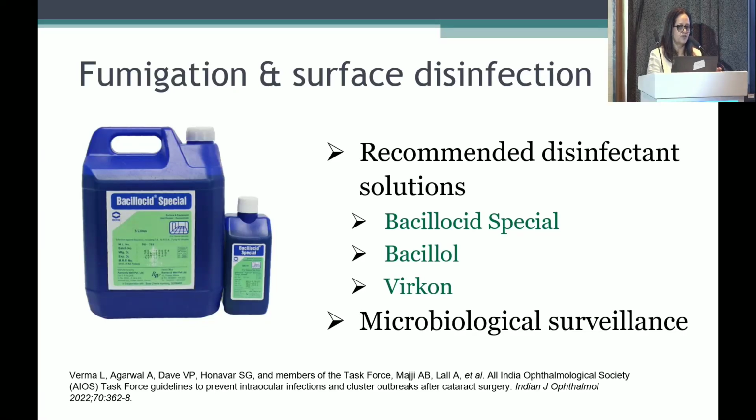So then coming to the fumigation, the OR as such, how do we sterilize that? Use standard solutions, bacillocid. Sometimes people try and save money on this particular aspect. I think this piece is very important. You'd rather save elsewhere, but do invest in important things like the solution which you are using for fumigating the OT. It's good to have the fogging machines which are available nowadays. Just have a time of about 30 to 60 minutes, so it's good to use these.